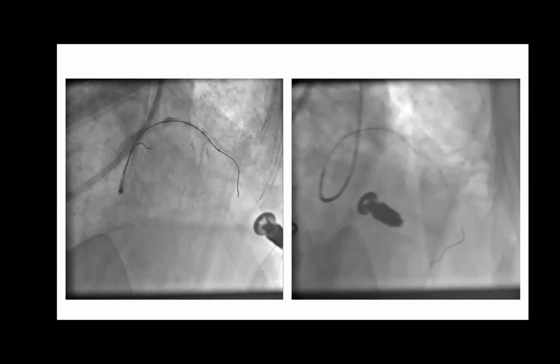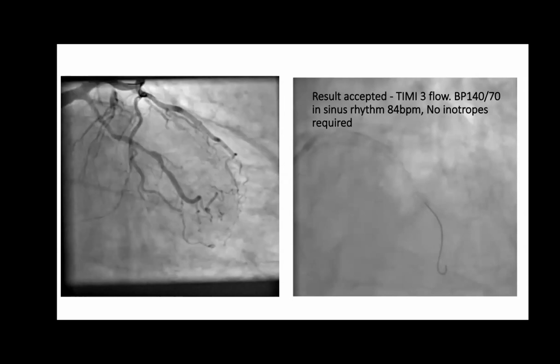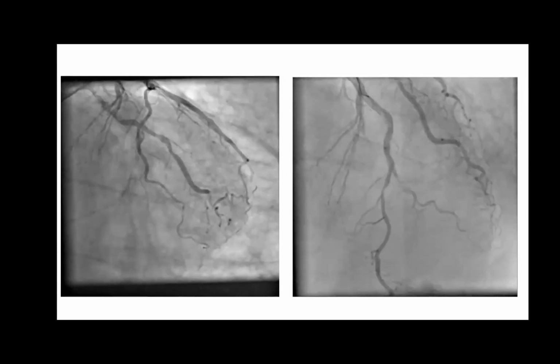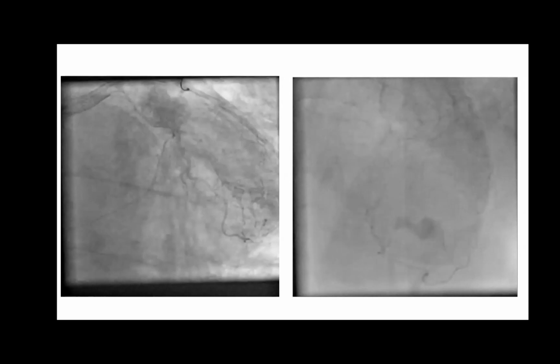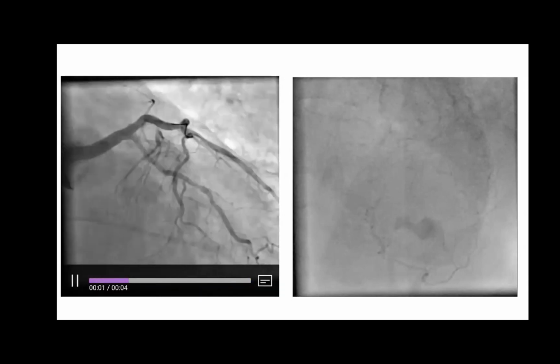and then we stented back from it. And can I just ask, was that a compliant or non-compliant balloon that you used, the 2.5? Compliant. Okay. I think it's easy to rupture a compliant balloon. Yes, yes, yes. I was going to say you have to go with a compliant, really. Yeah. It's a good trick to have in the back of your mind.